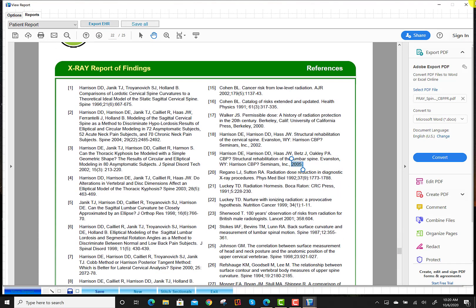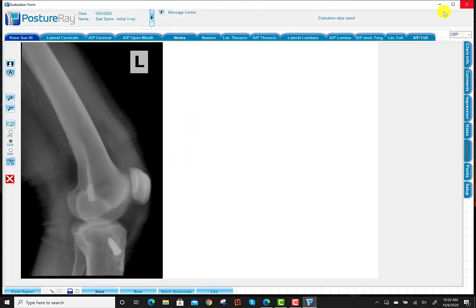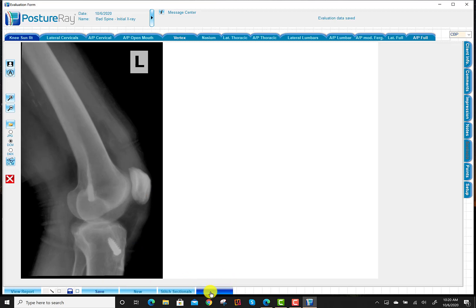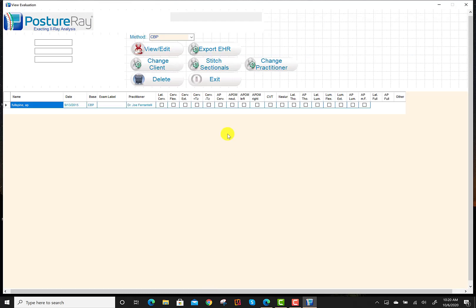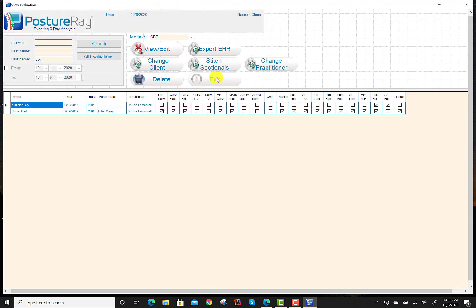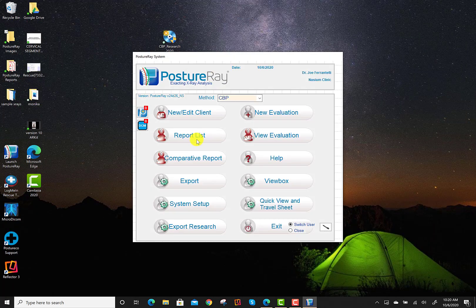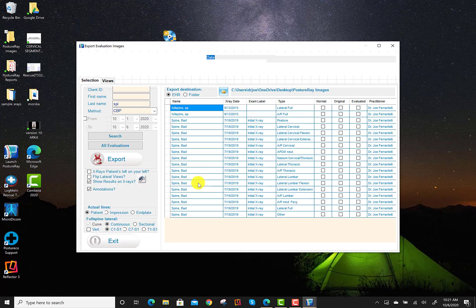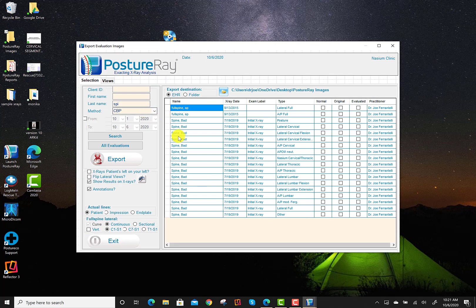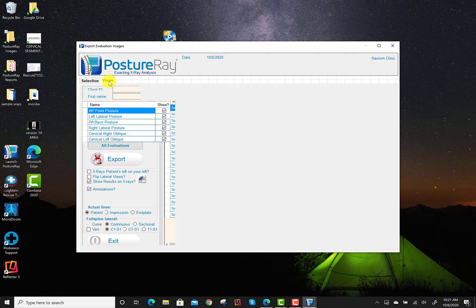So the next thing is you might be asking, well, I want to save just the JPEG image of the DICOM X-ray. So what we're going to do is we're going to go to the export feature. So in the main menu, we're going to hit export. Now, from this point, we're going to hit views.